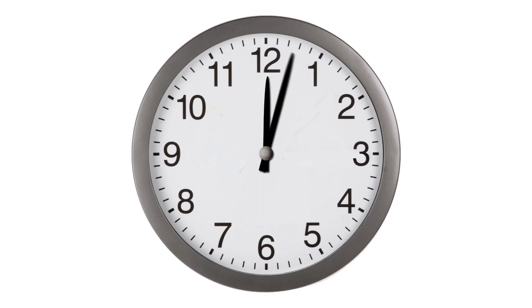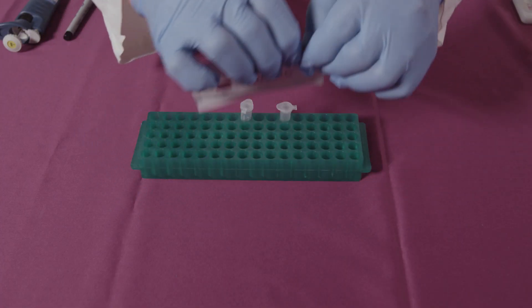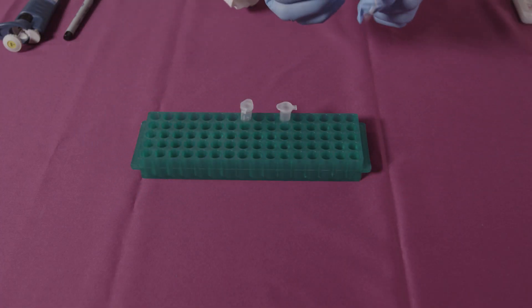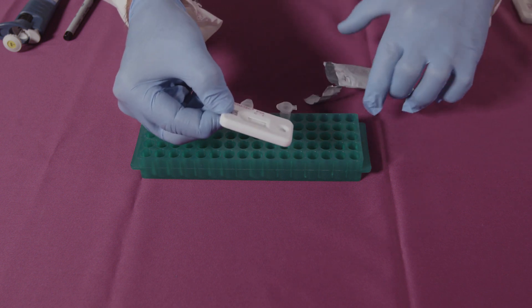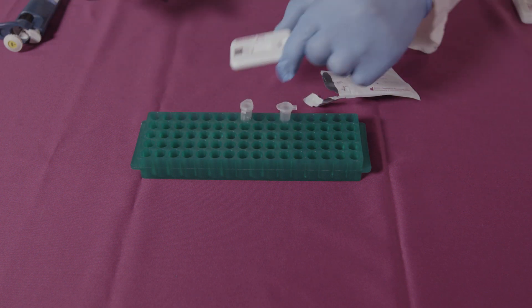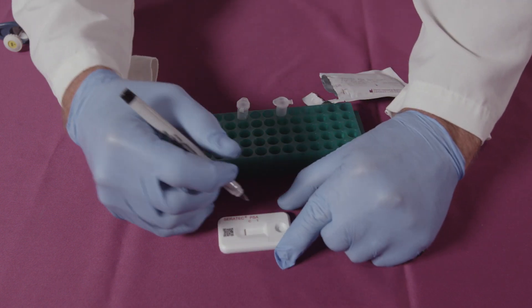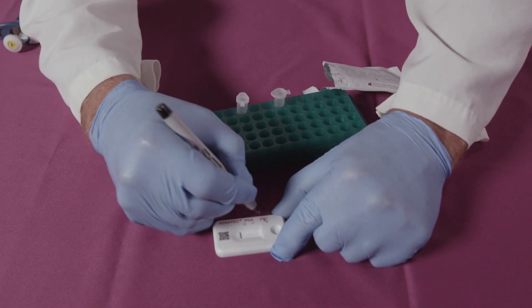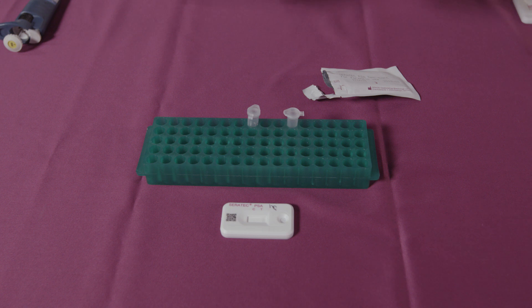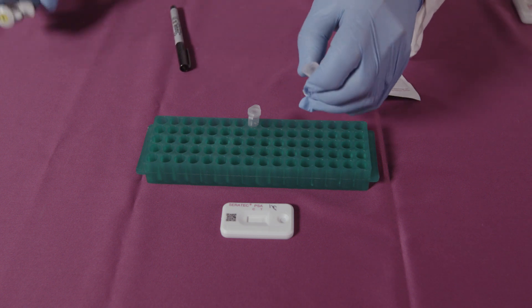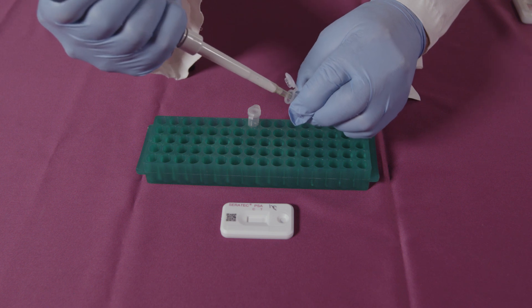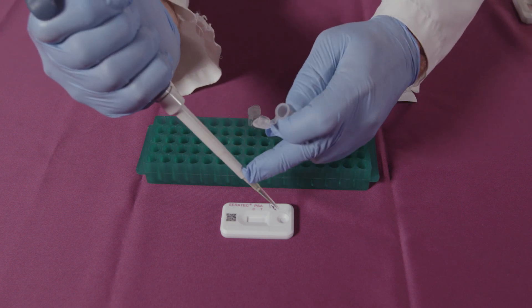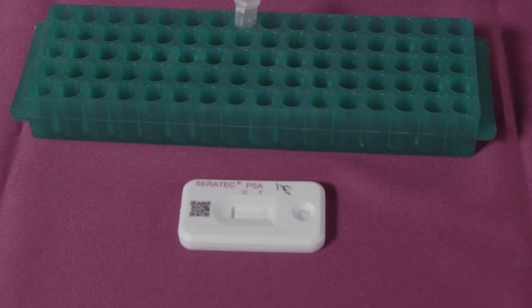To conduct a test, allow the sample to adjust to room temperature. Remove a cassette from the foil pouch and label it with an identifier. From the second microfuge tube, remove 120 microliters of sample and add to the hole in the cassette. You will see the sample begin to travel up the membrane.